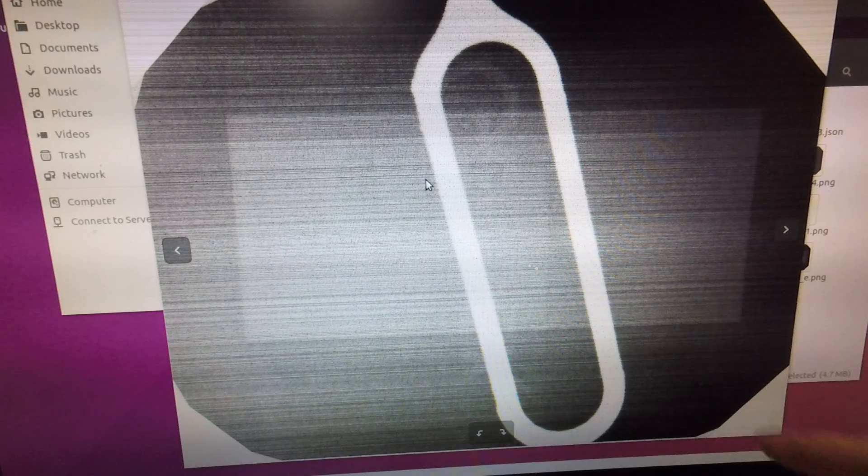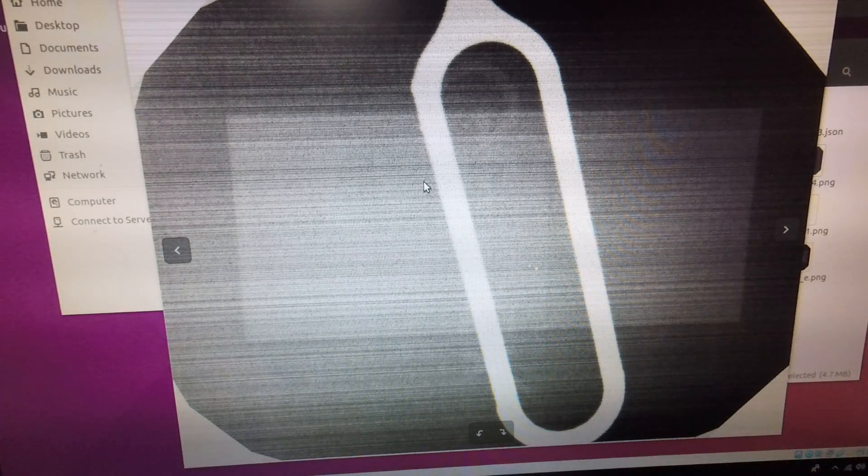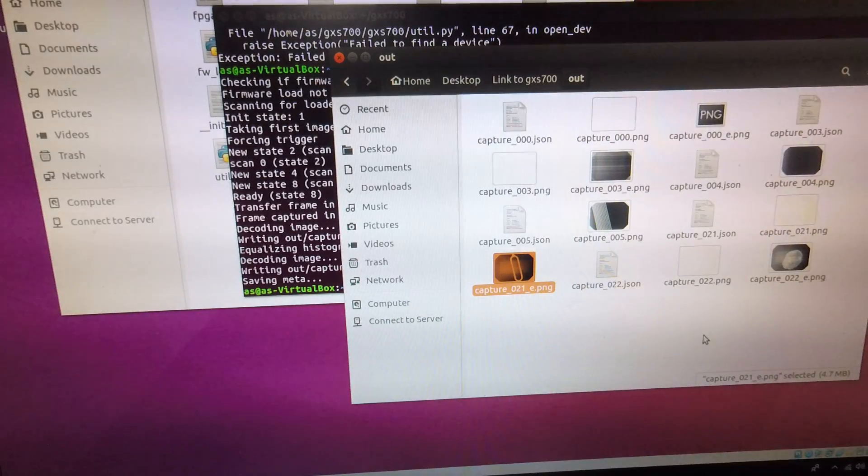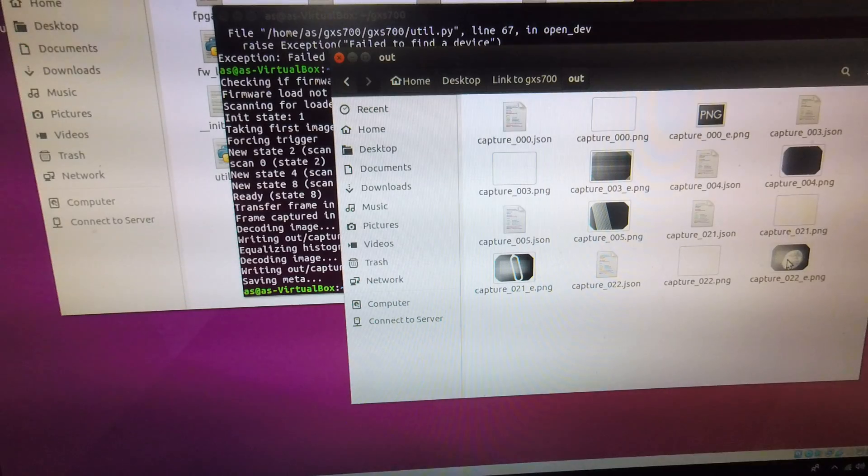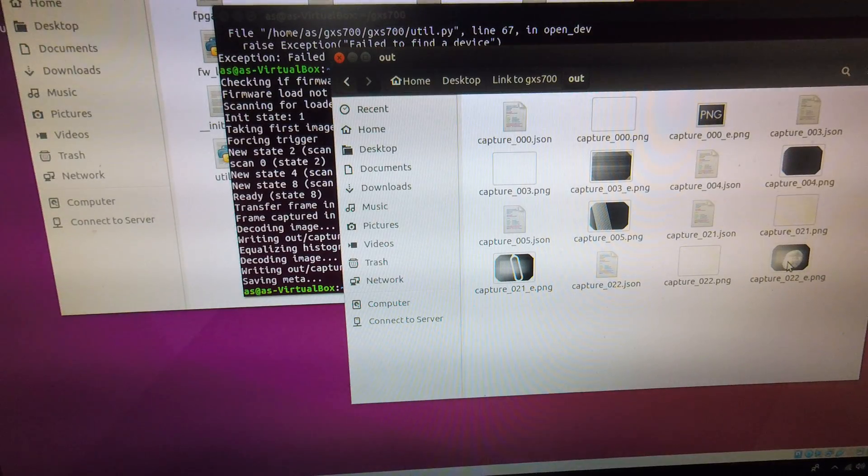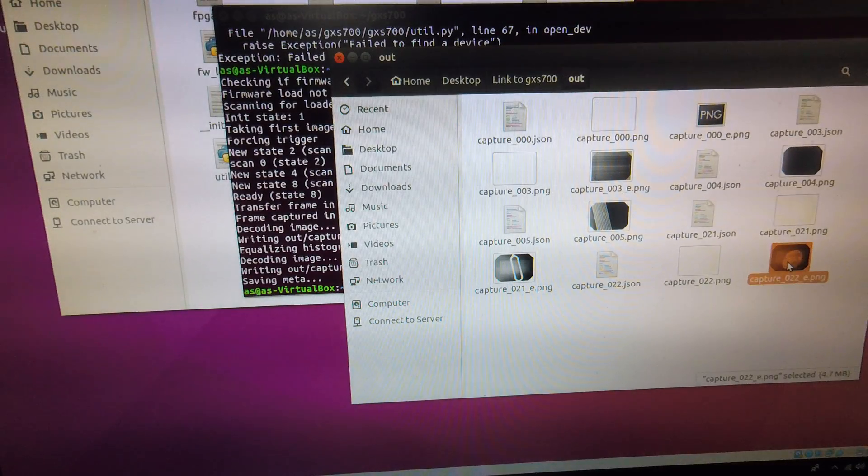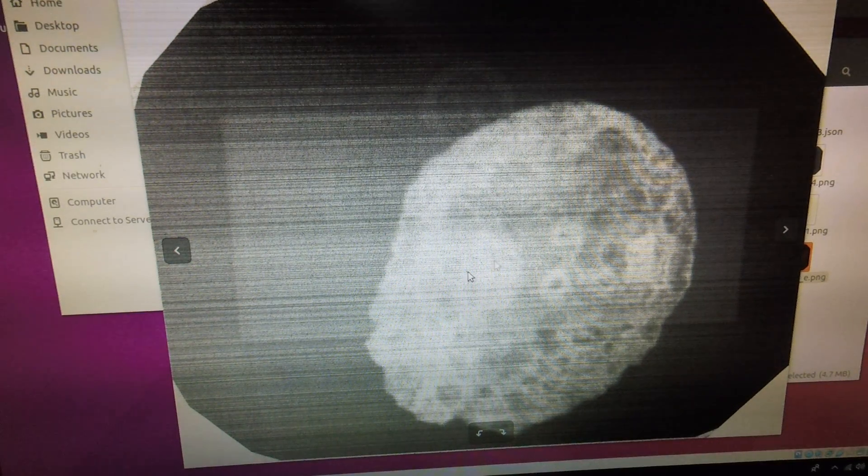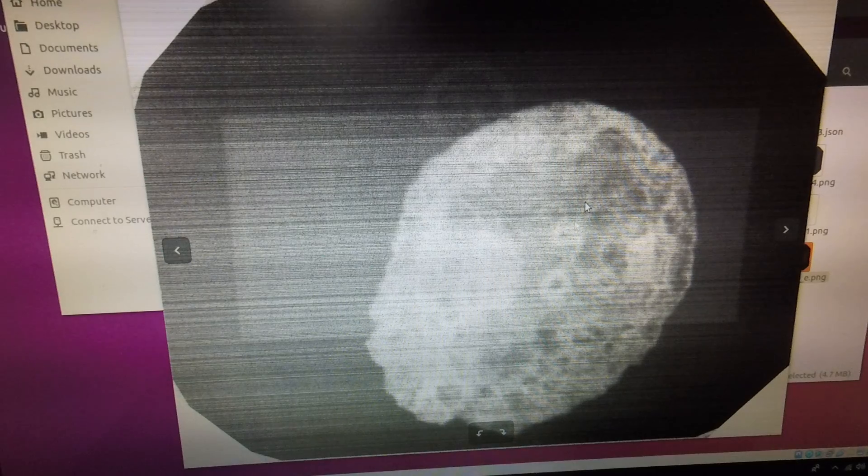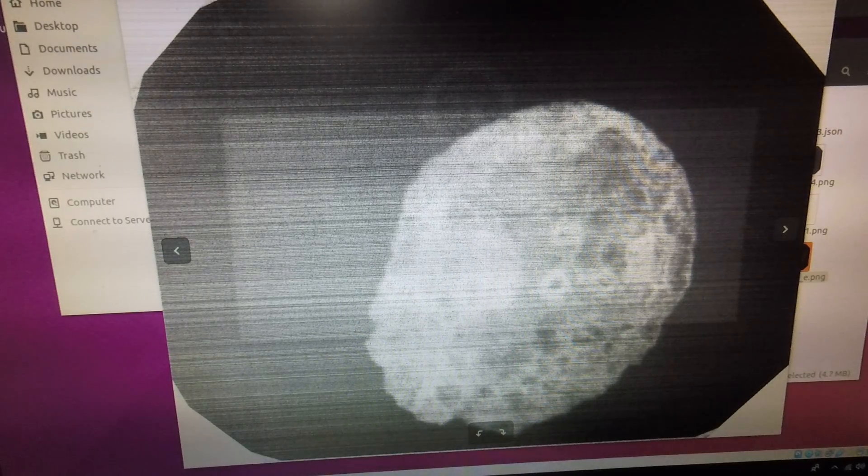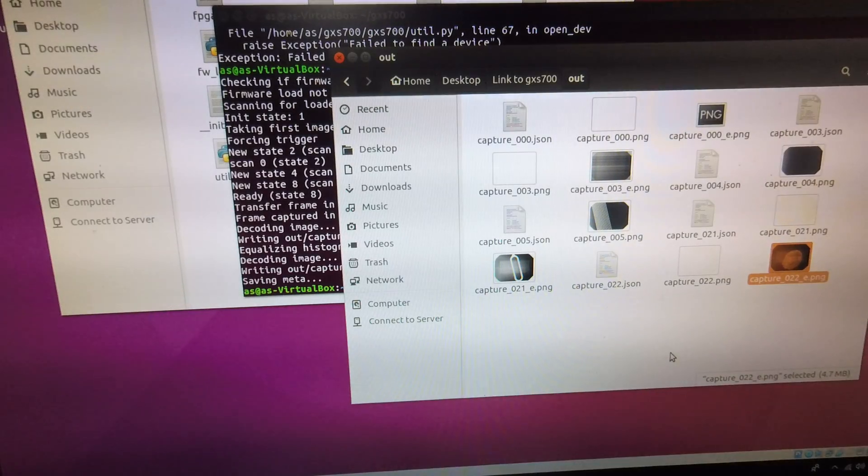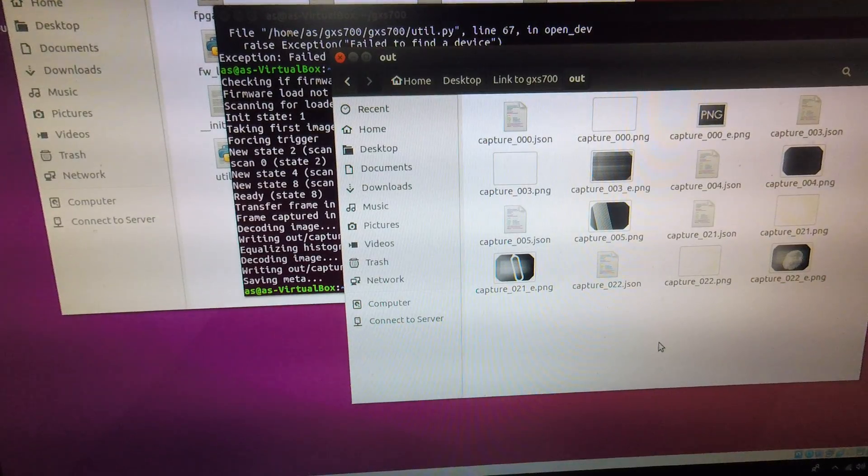But it does work so that does give some potential use for a portable, very compact x-ray system. And here's also a picture of a cornflake. So you can x-ray things which are traditionally not very absorbent of x-rays.